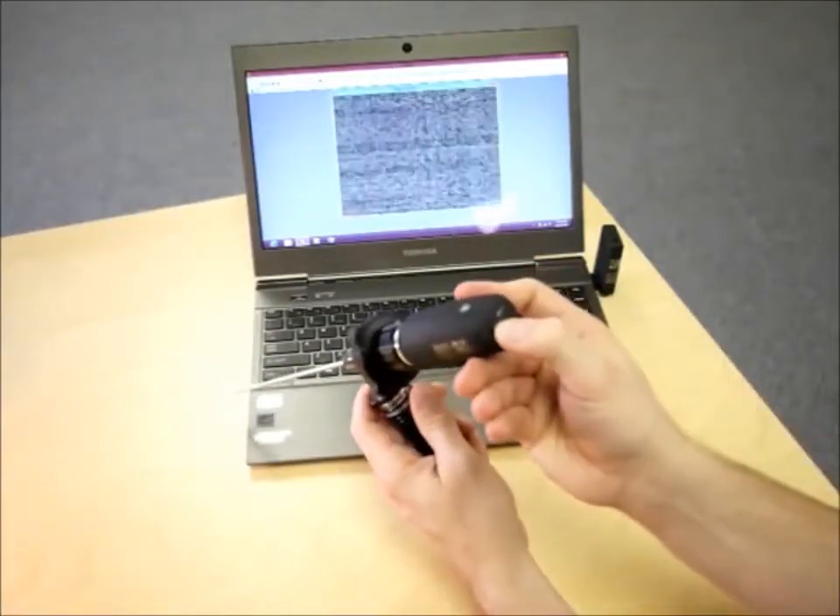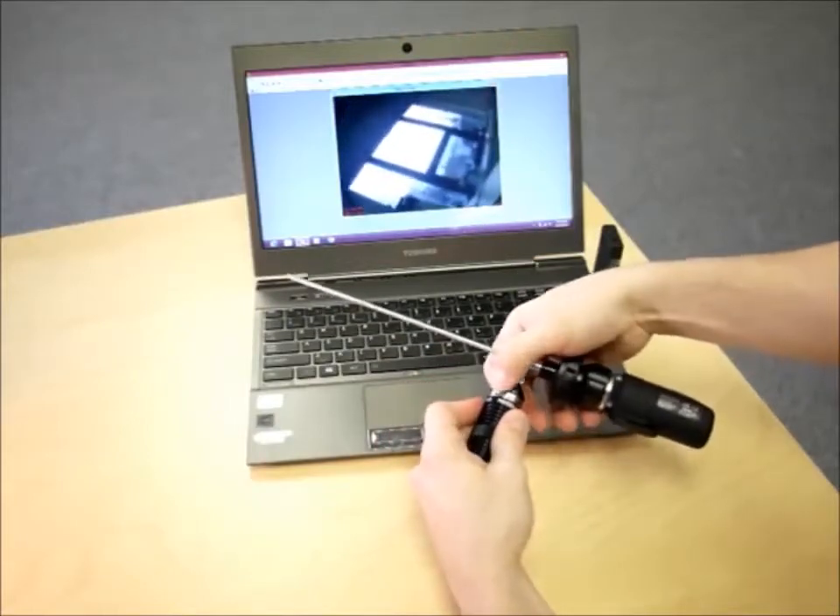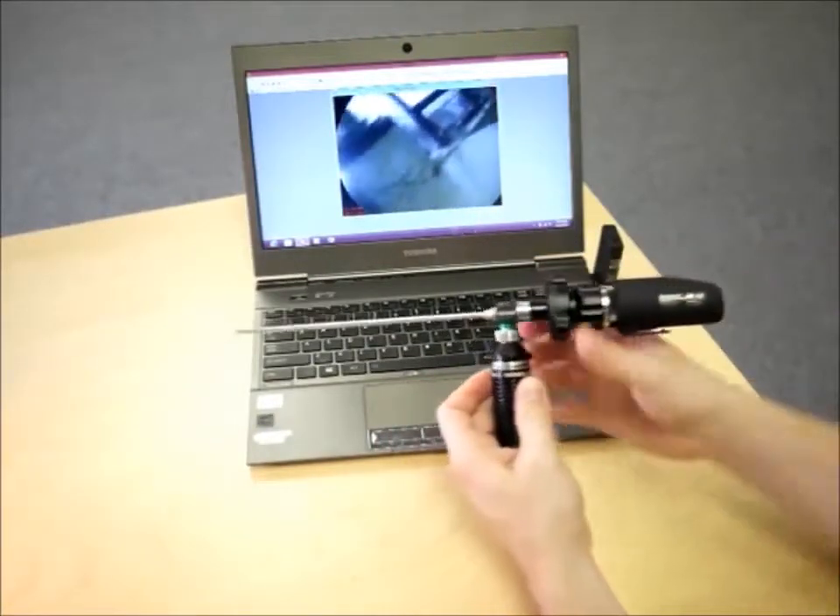Press the button on the back of the DE-1250 to start a live feed with the computer. Turn on your light source and you're up and running.